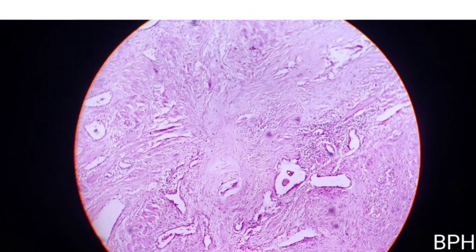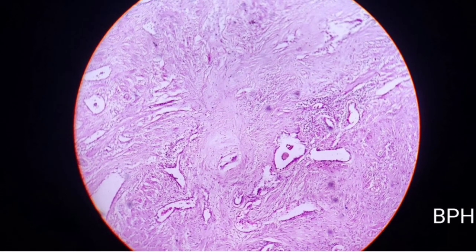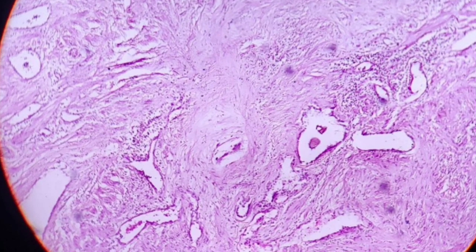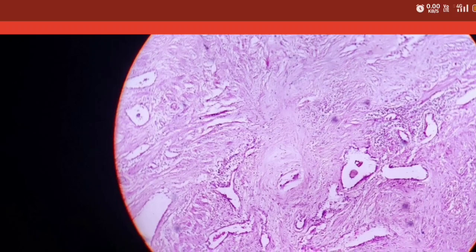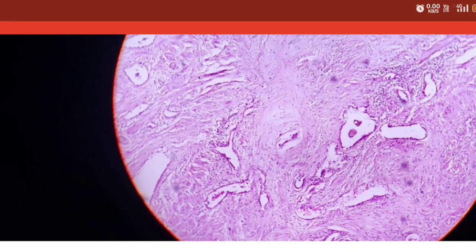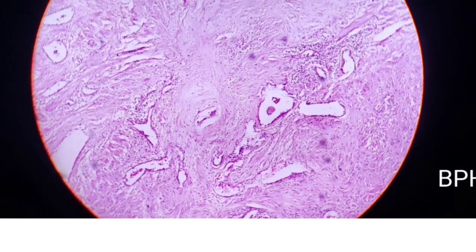Next is benign prostatic hyperplasia (BPH). As age advances, androgen levels decrease and estrogen concentration increases. The periurethral glandular region responds most to estrogen, leading to BPH. On the slide, you can see proliferation of both the fibromuscular and glandular parts. BPH is not a tumor.